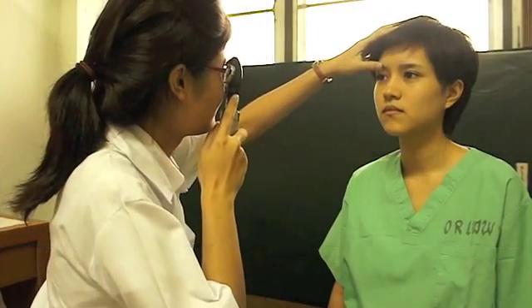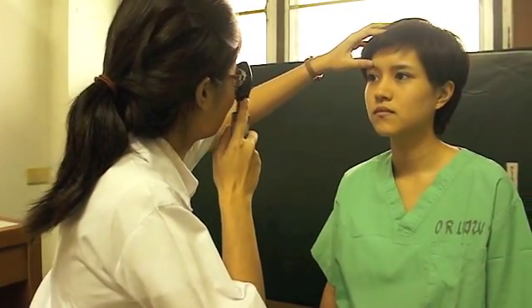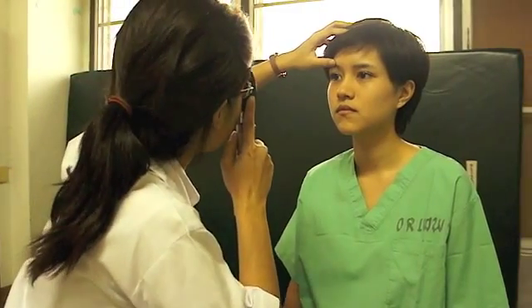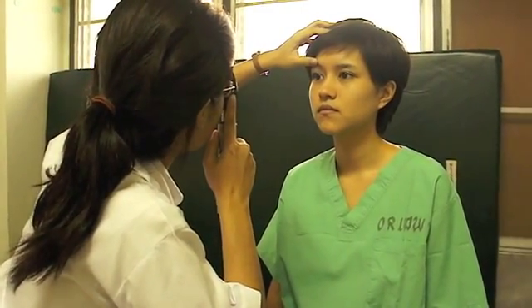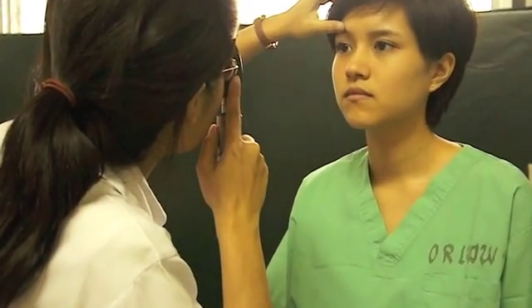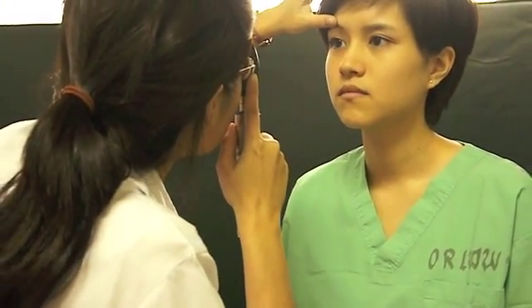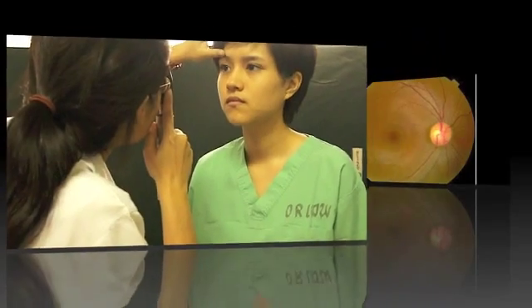เริ่มมองจากระยะ 1 ฟุต ใช้ตาขวาดูตาขวาของผู้ป่วย มองผ่านรูม่านตา จะเห็นแสงสะท้อนเป็นสีแดงส้ม เรียก Red Reflex จากนั้นจึงเข้าใกล้ตาผู้ป่วยมองดู Optic Disc (Begin at 1-foot distance; use your right eye to observe the patient's right eye. Look through the pupil — you will see an orange-red reflection called the Red Reflex. Then approach closer to examine the Optic Disc.)